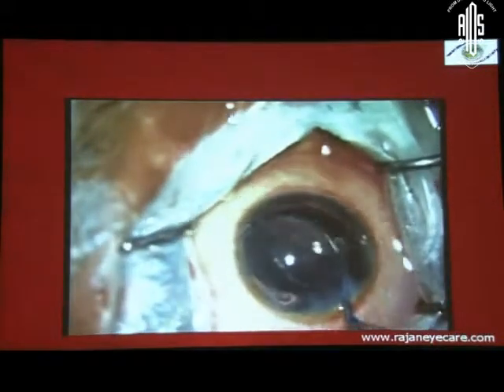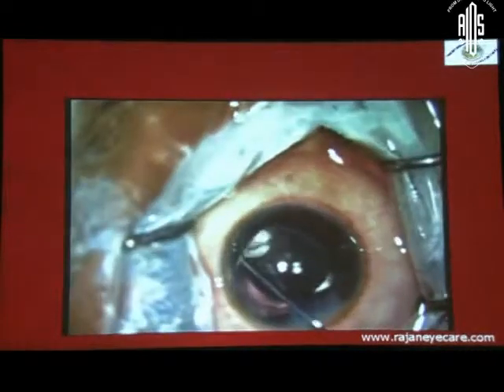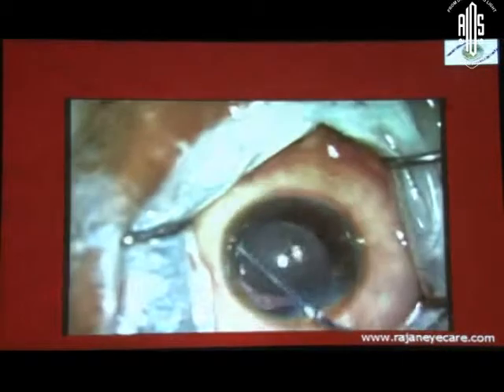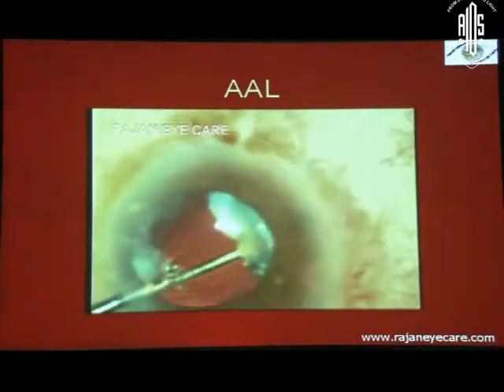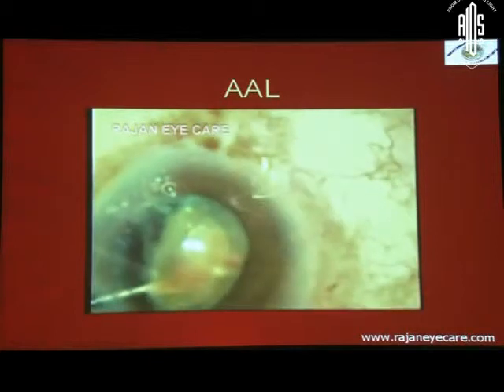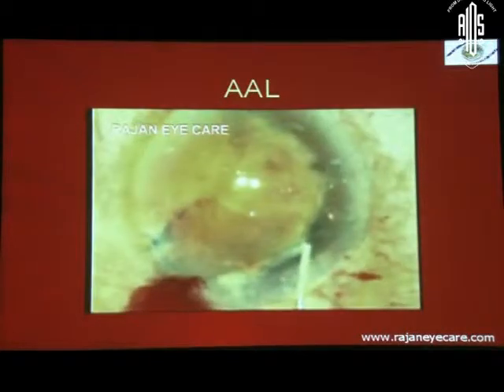This is called the anterior assisted levitation. When you have a lens drop or a nucleus drop, I will show you, if you have time, one more clipping. This is called the anterior assisted levitation. This is a hypermature cataract in a very old patient. The patient had cardiomyopathy as well, so I couldn't get a physician fitness.